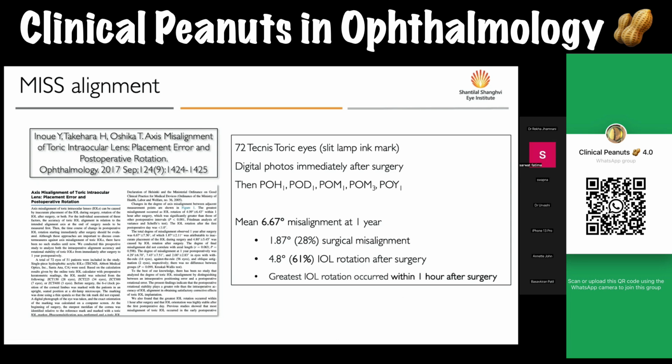And this was quite an interesting finding, because it means that if your IOL is stable after the first hour of surgery, it's more likely to stay stable throughout the subsequent follow-ups.